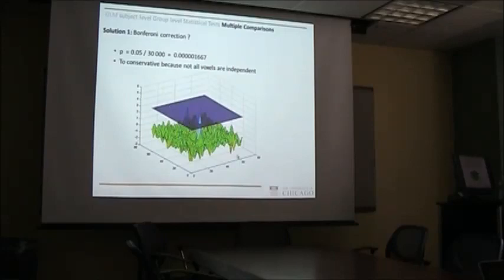I showed a similar plot like this before, but now imagine that this was a slice of test statistics, right? So this is a slice of the brain where each value represents a t-value. Does that make any sense? If you would just take one part of the brain, say this little thing here is a t-value of maybe 2, and this one here has something like 0.5, right?